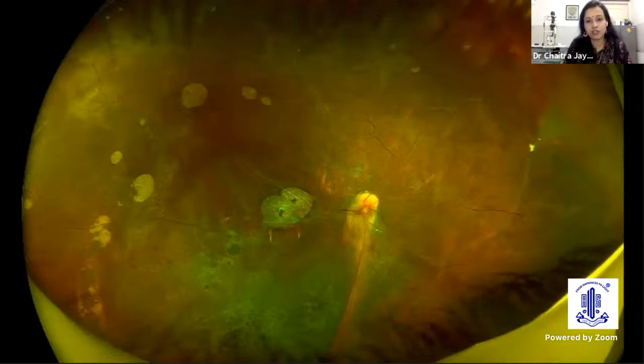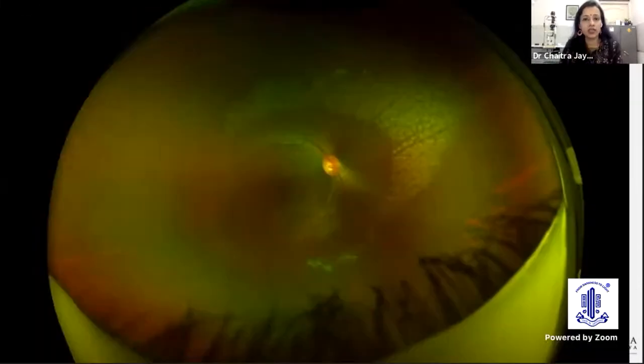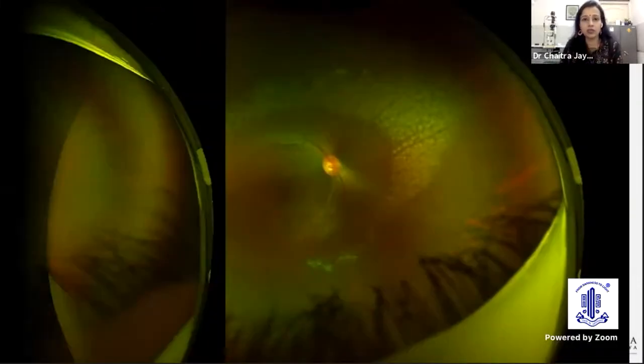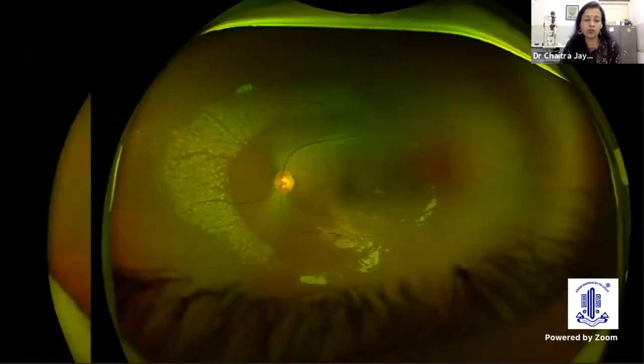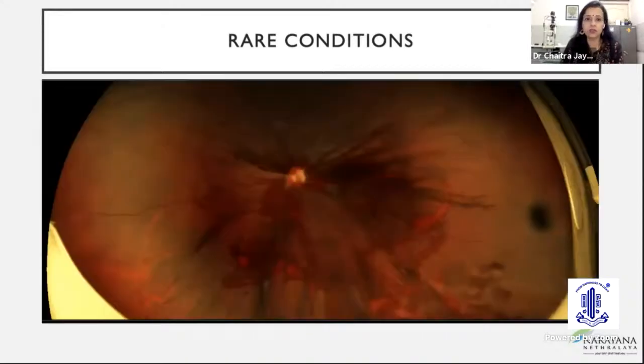This is rather unfortunate. The father is a badminton coach, national coach. His child has this. We are unable to actually come to a diagnosis, but you can see the extensive dysplasia in one eye. The other eye, fortunately, is good enough. This is again a dystrophy in a very young child. We could document in both eyes. Came after visiting several centers. Some rare conditions, as you can see here, presented quite late, looks like a dystrophy. We are still investigating the patient.